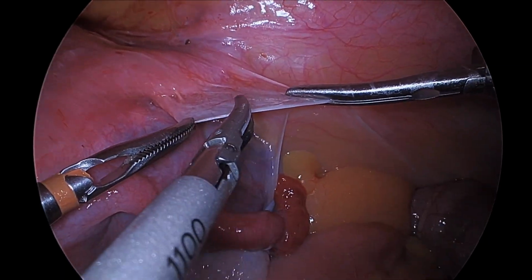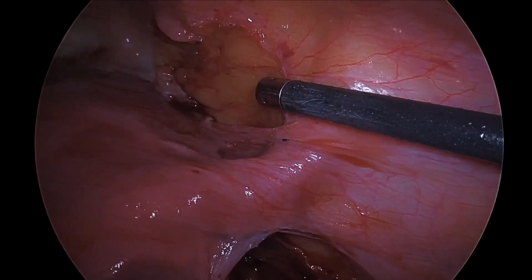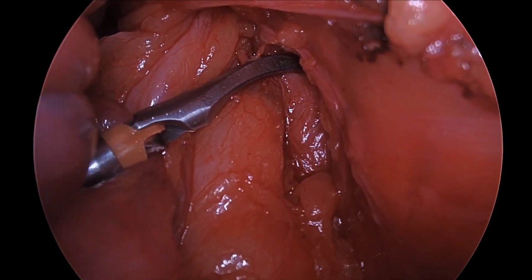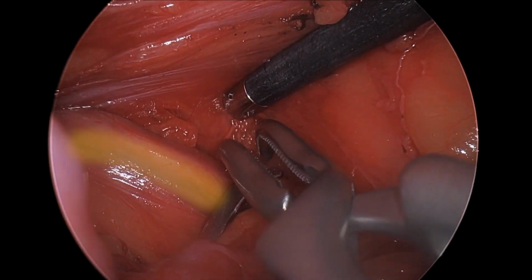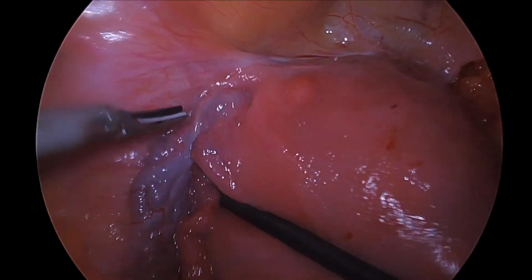Note the previously dissected paravesical space on the right, the round ligament, and the lateral dissection to identify the ureter and internal iliac artery. The internal iliac artery was isolated and then grasped to facilitate placement of a vascular bulldog clamp. The right ureter was reflected medially as the bulldog clamp was introduced. With the clamp securely in place, attention was turned to the left side.